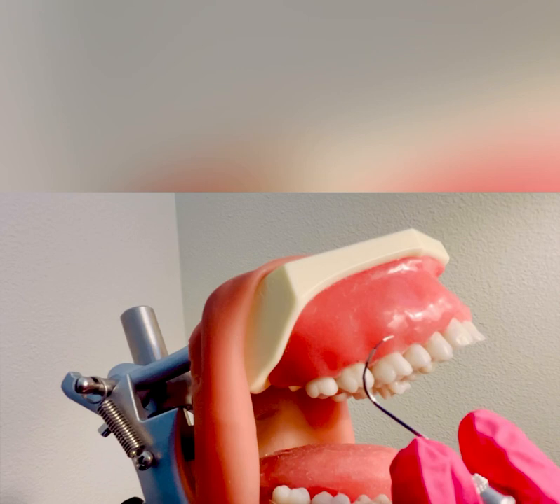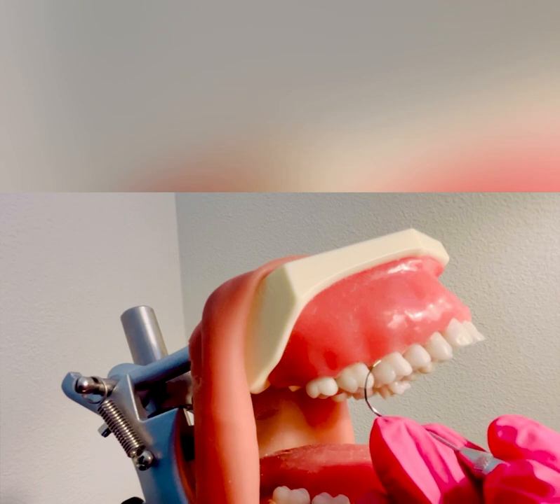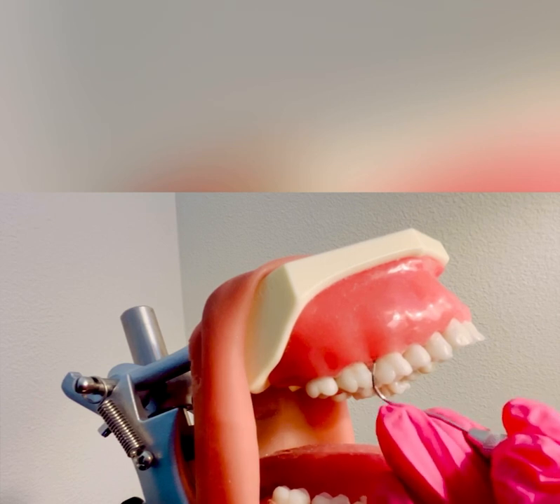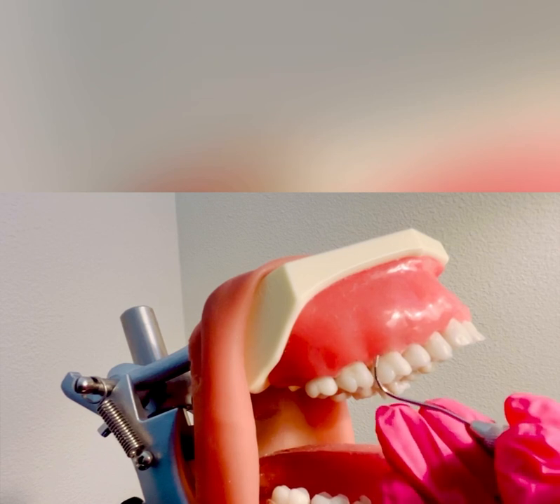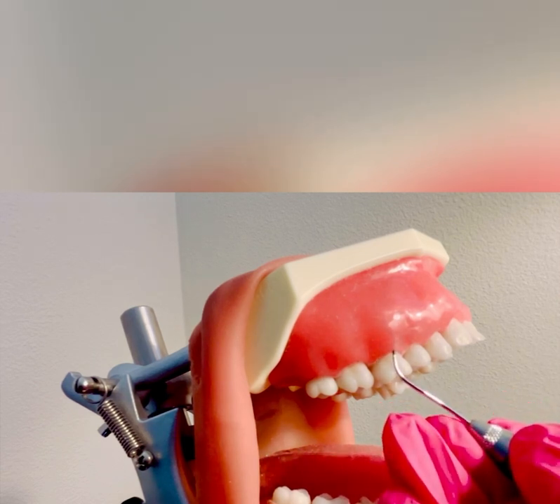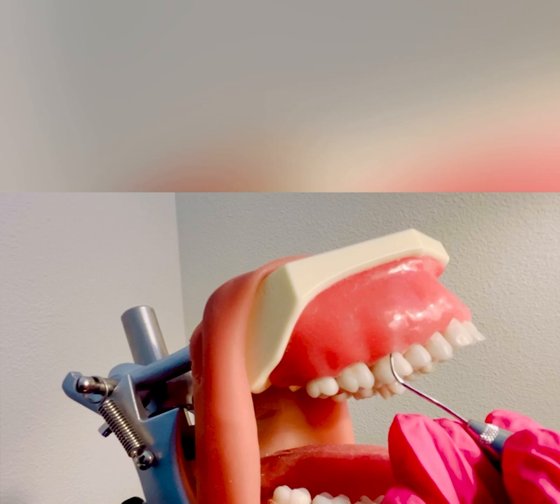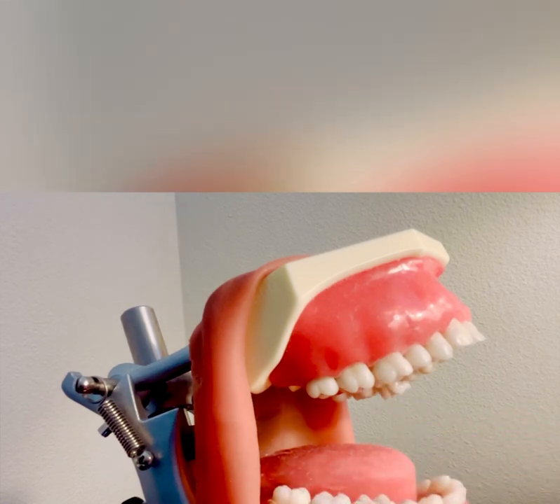Flipping it back to the correct working end — I have a modified pen grasp, extra oral fulcrum, good ergonomics. I'm going to insert the Nabers probe subgingivally, using a very light sweeping motion similar to an exploratory stroke. I feel the opening between the two roots, and I am able to roll into the furcation and I am going through and through. I can't clinically see the furcation, so this would be a grade three. That would be assessing the buccal surface.